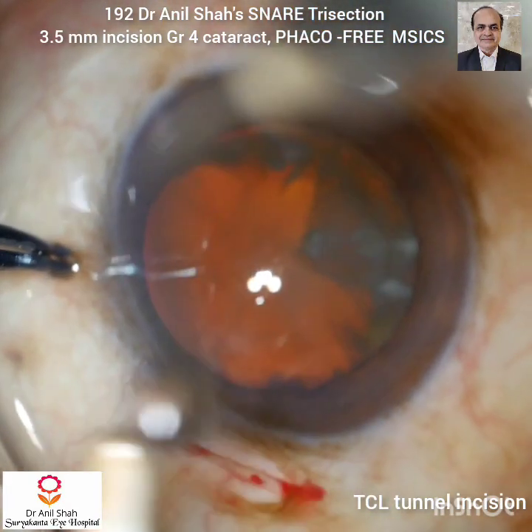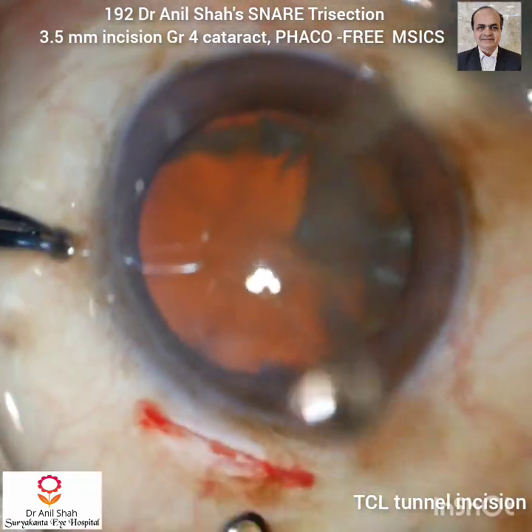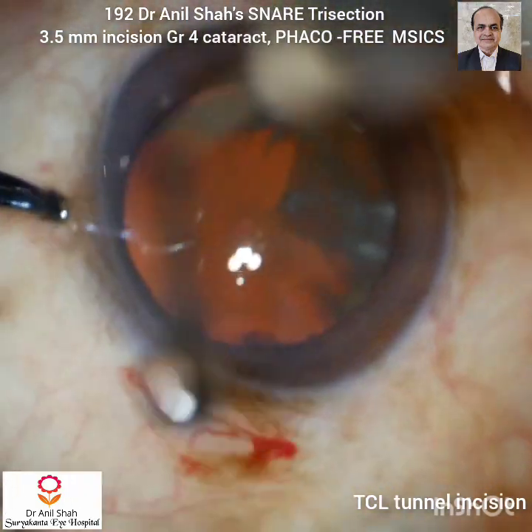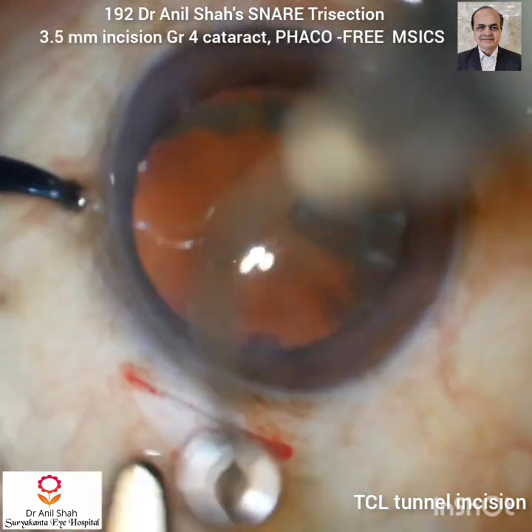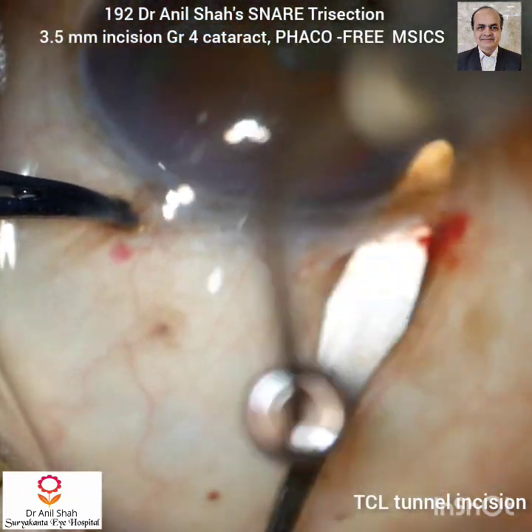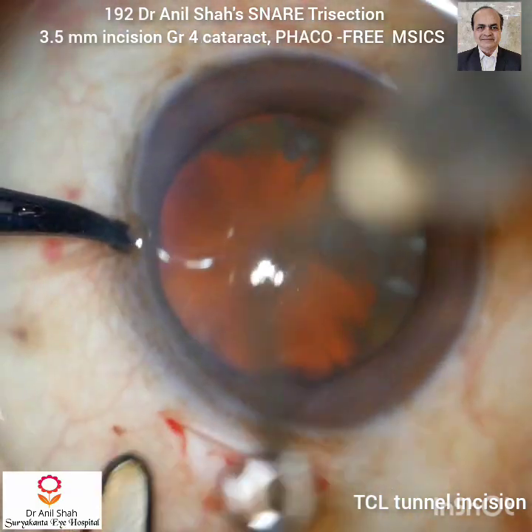Normally I prefer transconjunctival limbal tunnel incision. It is usually 3.5 mm to 4 mm and it is more towards the limbal side. The width of the tunnel is also small, so it is a shorter tunnel. The shorter tunnel has the advantage that the snare can go directly into the anterior chamber, engage the nucleus, and divide it into two sections.